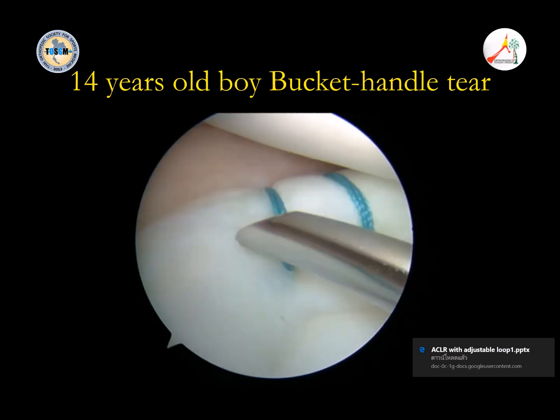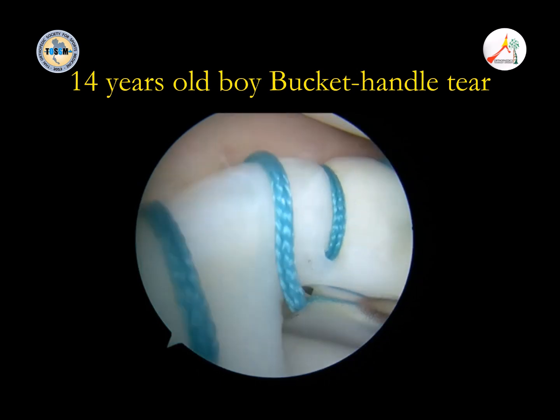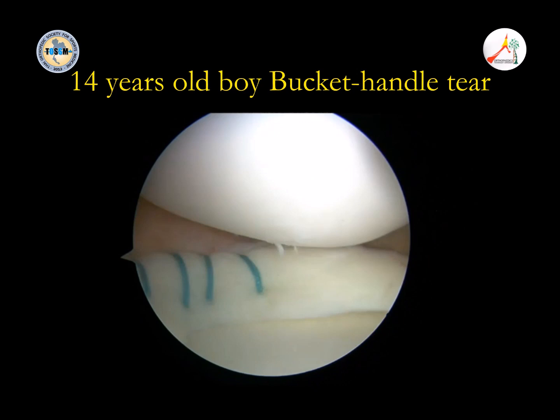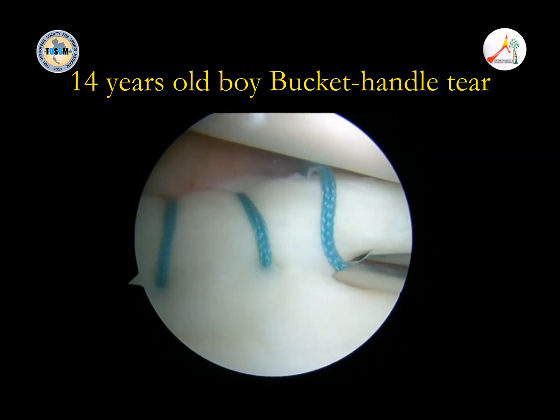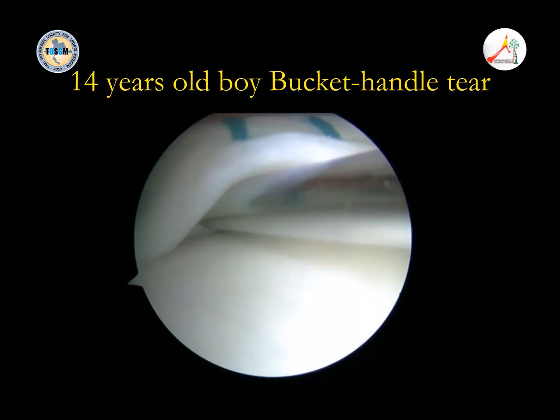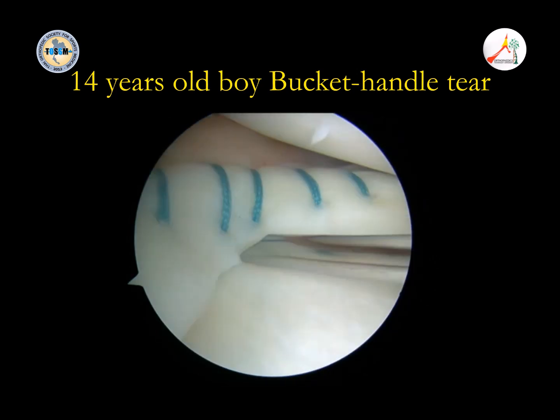Smith will not be so happy because this is quite cheap, but actually I do it combined. I do inside out, and in the posterior part I do all inside. But the study comparing inside out and all inside for bucket handle shows no difference. But I prefer to do it this way.